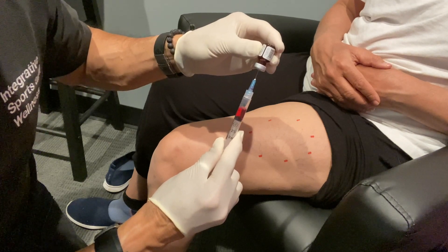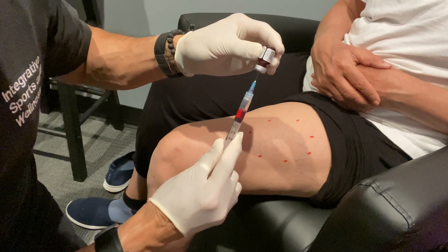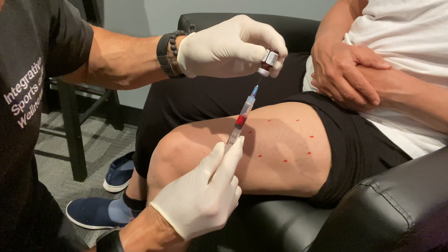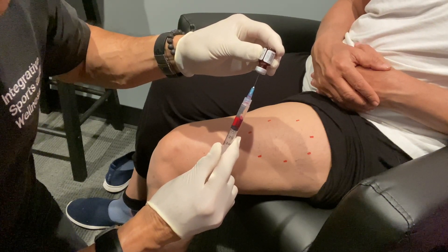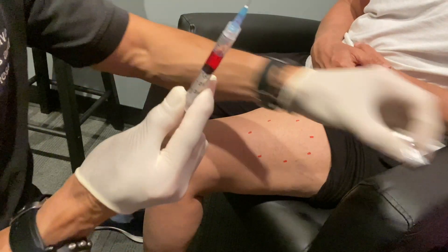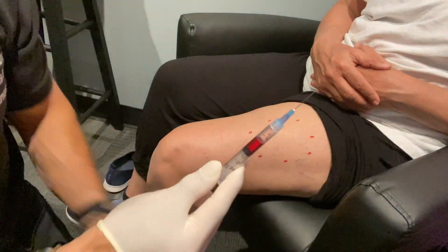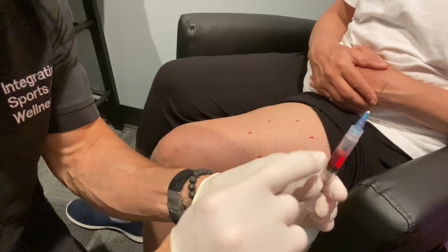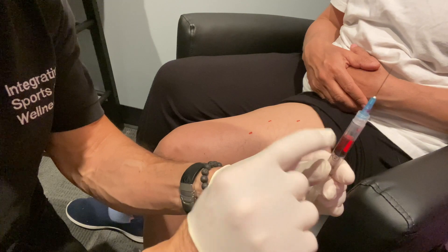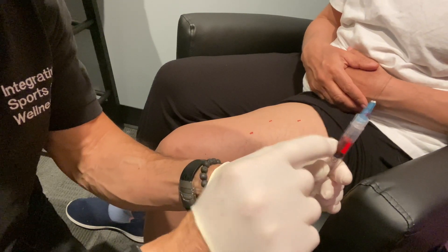These vials are so tiny. It looks like as I pull the needle almost all the way out, I'm catching as much of the fluid as possible. We have everything. Watch the needle — don't stick yourself. Put the vial off to the side. Make sure all the fluid is down. Tapping the fluid down will drop all the droplets.